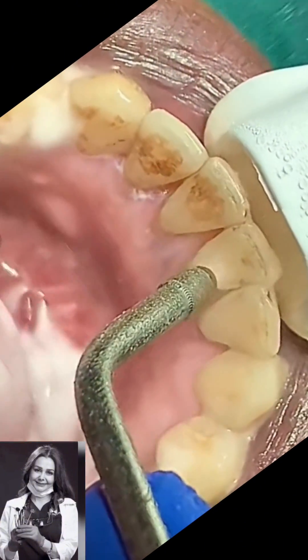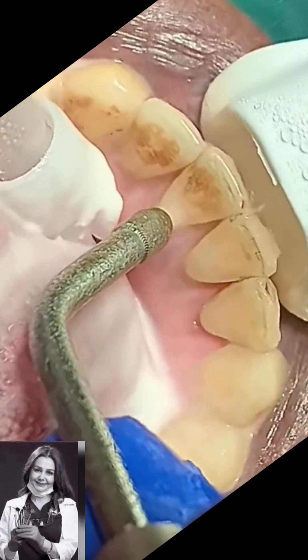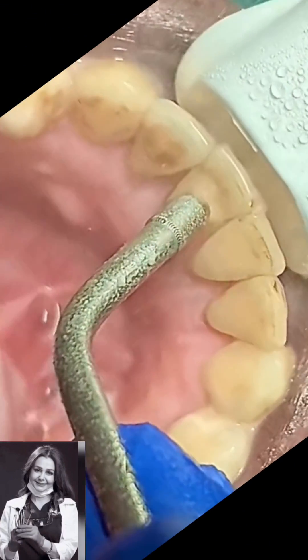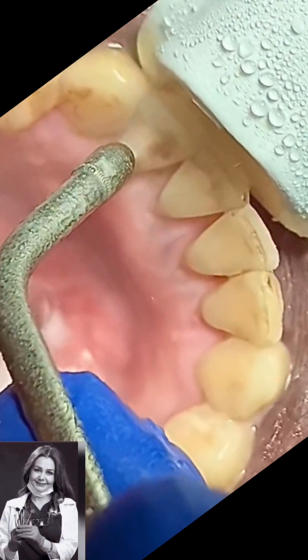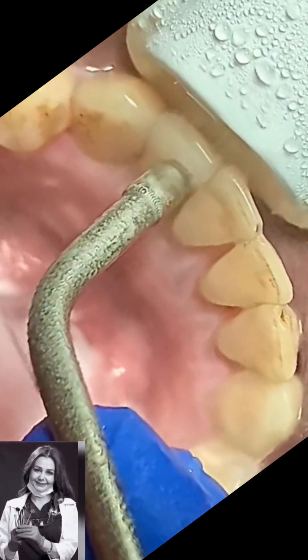The procedure usually does not cause side effects. However, some patients complain of short-term tooth sensitivity or slight, but quickly healing, gum irritations.